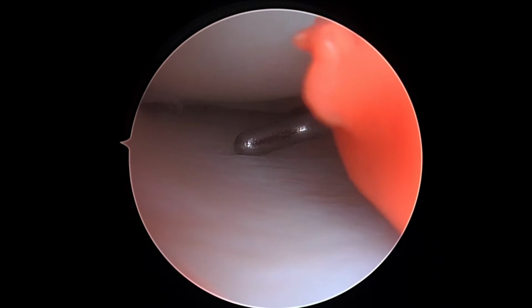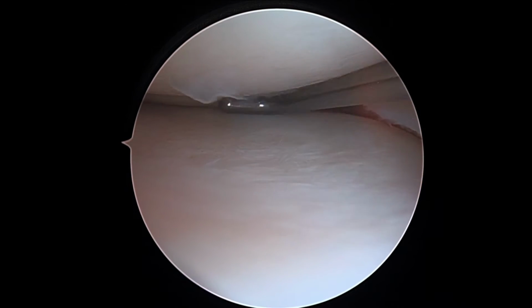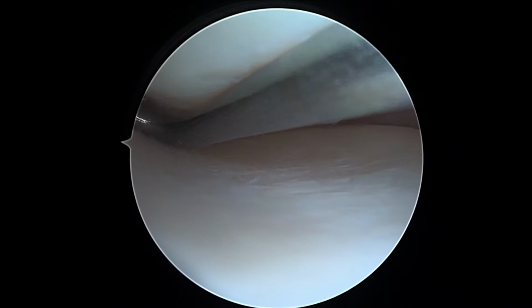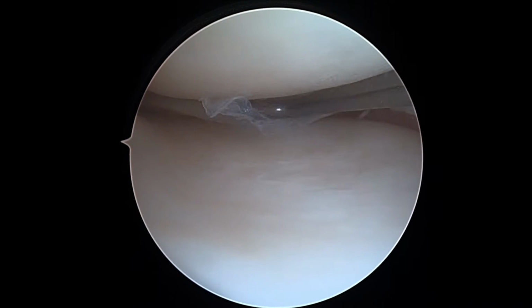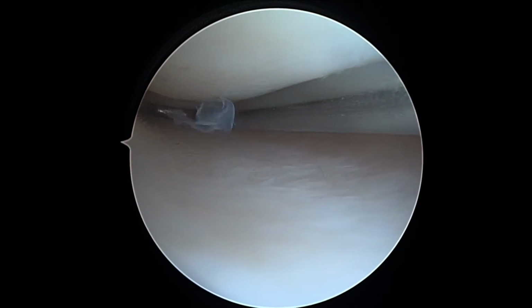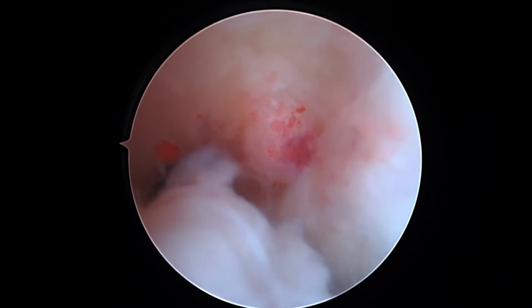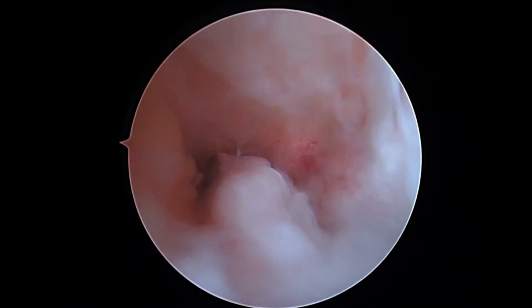Okay, so the articular surfaces look good. The tibial plateau looks good. The femoral condyle up above looks good. Table down just a little bit, please. Great. And so now we can see the posterior horn, and we know from MRI scan it looked perfect, and so far I haven't seen anything to make me doubt that. That looks really good. We'll look in the central part of the knee.